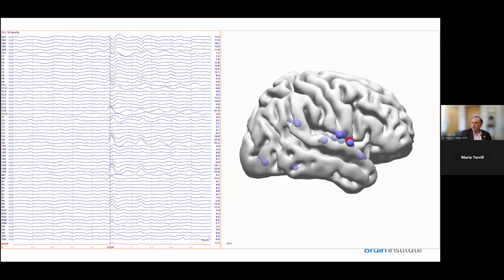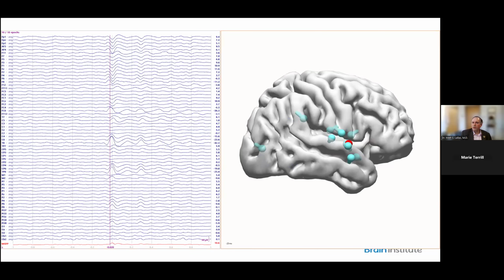But if I then said, well, what if I did a low frequency filter of 3? Because the past one was at a low frequency filter of 1. And now, okay, there was one down here that isn't there anymore. It's actually come a little closer. We've potentially gotten rid of some of the noise and increased our signal. And then here I've said, well, I only want to see the spikes that at least explain 60% of the signal.